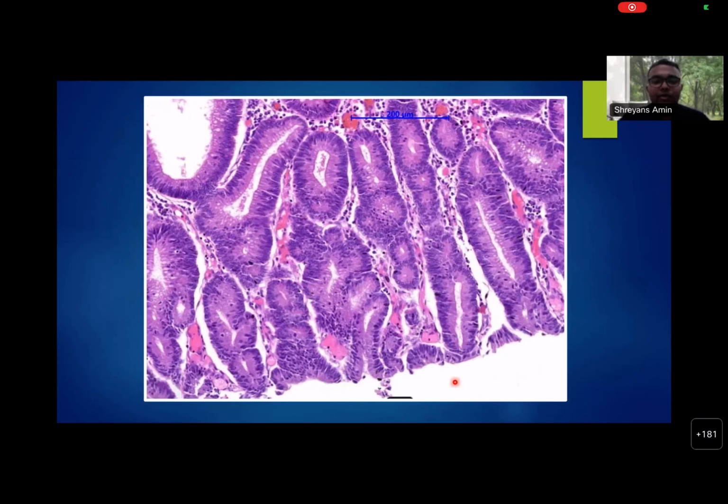And I think you shouldn't focus too much on the stroma or the blood vessels. I think we should concentrate more on the glandular features and especially their nuclear features, because that is what is going to tell you whether this given polyp is an epithelial polyp and whether it is dysplastic or not, and that would then be equivalent to the diagnosis of adenoma. And then it is a matter of how much dysplasia there is, low or high. But first, let's get it correct that indeed this is dysplasia. That is the first step, and I'll just tell you what features to look at.